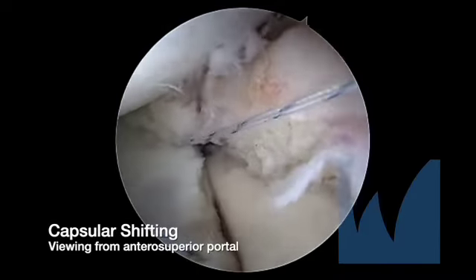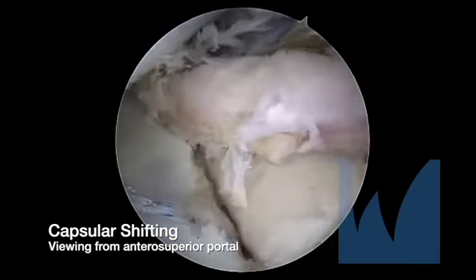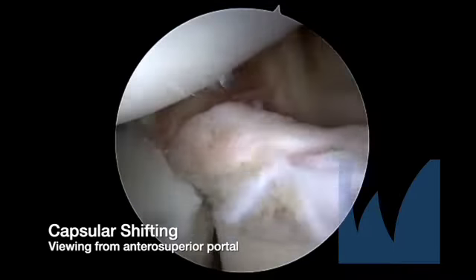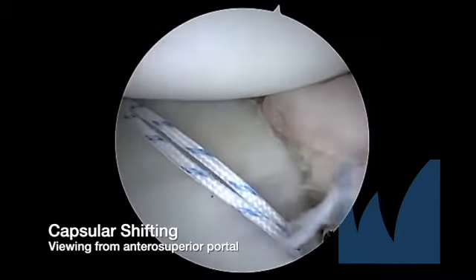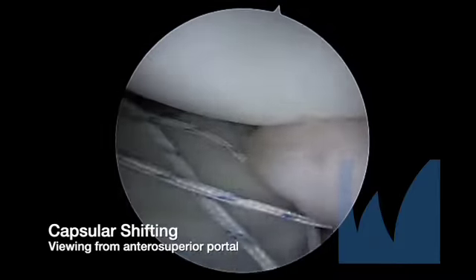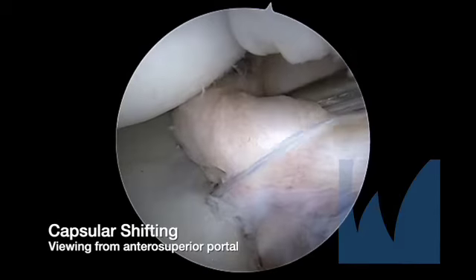The suture tails of the inferior anchor are then tied with a modified clinch knot using a knot pusher and needle driver through the antero-inferior portal. The process is repeated with the tails of the superior suture anchor. The capsule has now been shifted superiorly, yielding a bumper of tissue at the margin of native glenoid and graft. A knot cutter is used to cut the tails to 2 millimeters.